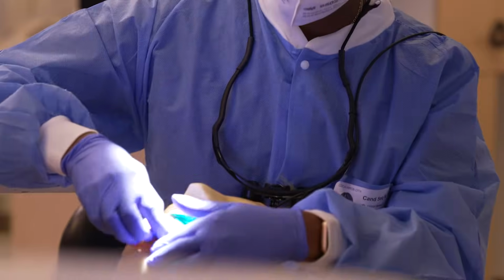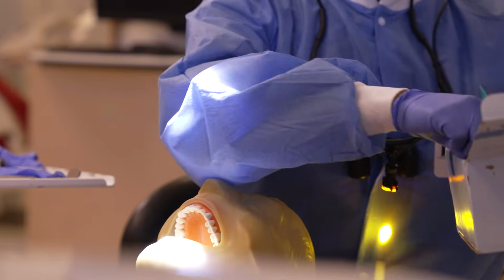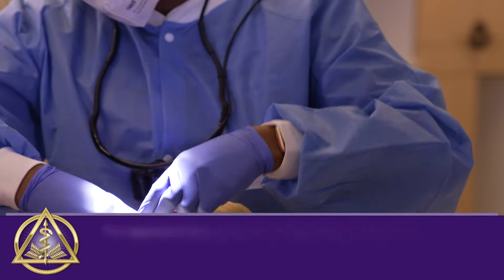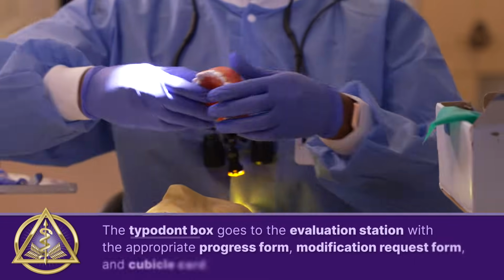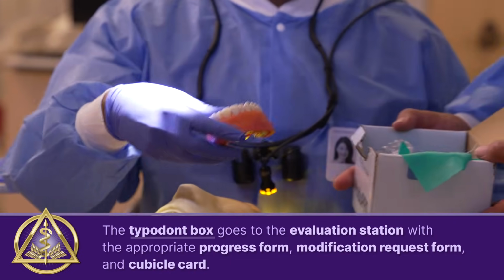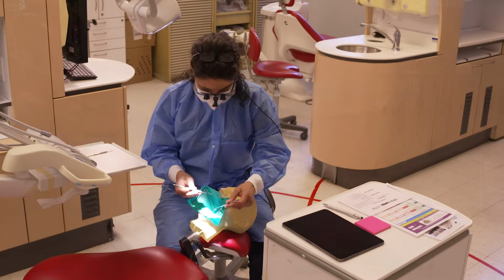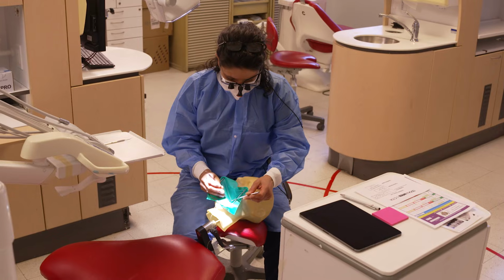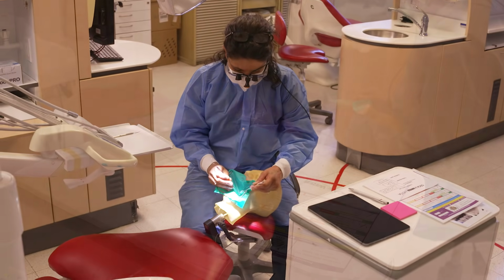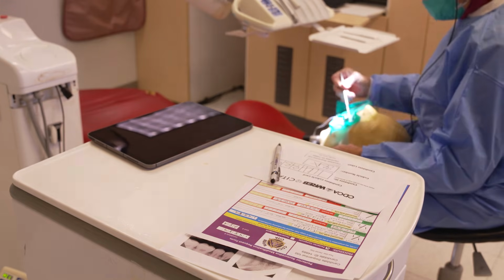Remove the maxillary and mandibular arches with the rubber dam in place and place them in the typodont box. The typodont box goes to the evaluation station with the appropriate progress form, modification request form, and cubicle card. Runner, please. Modification requests will be reviewed in the express chair. There, your request will be expedited in order to afford you the maximum working time possible.